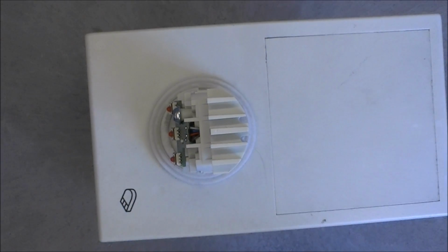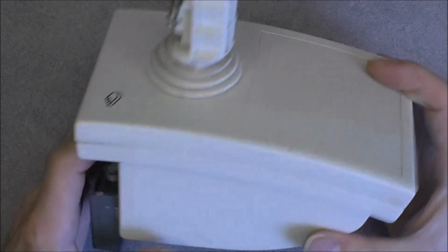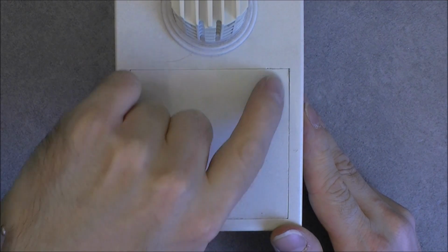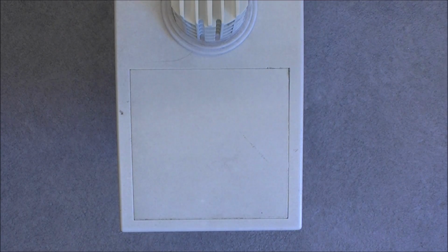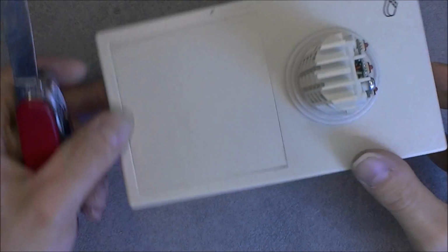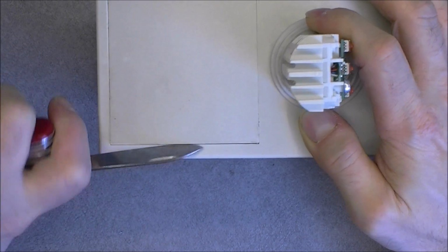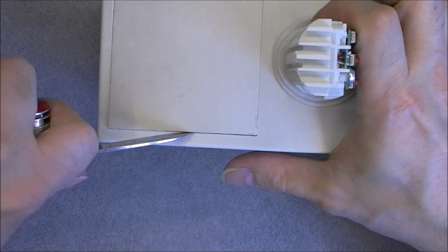Okay, so the main big hand piece is off, and it is what I wanted. And already quite a lot of parts. So before we continue at the bottom side, I noticed something here. Look at this blanking plate. It looks like someone did try to insert some tool in here to remove the plate. So I wonder if we have anything of interest or not behind this plate. So let's try. Yes, it is lifting. It looks like a little bit difficult, but it may come off eventually.